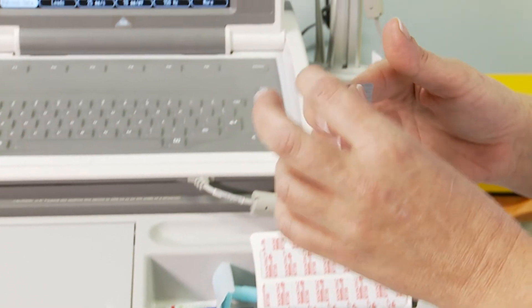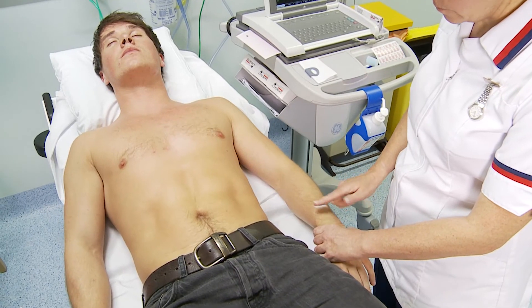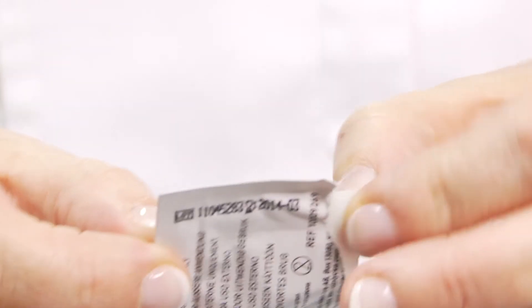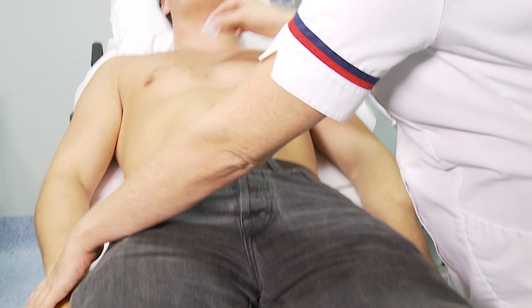Using the abrasive preparation pad, lightly exfoliate the skin surface. Then using the alcohol-based cleansing wipe, clean the skin over the exfoliated sites and dispose of the wipe in a clinical waste bin.